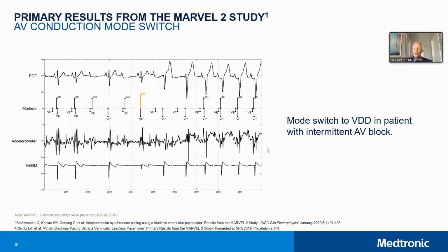Obviously, we would think this would work well in people that have complete heart block all the time, where this isn't an issue. But this allowed us to understand that the mode switch algorithm actually allows us to use this in people with intermittent AV block also.